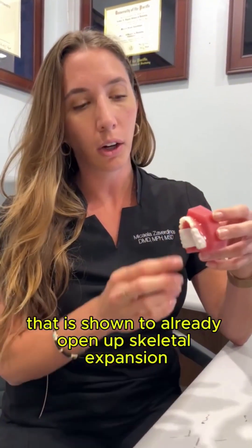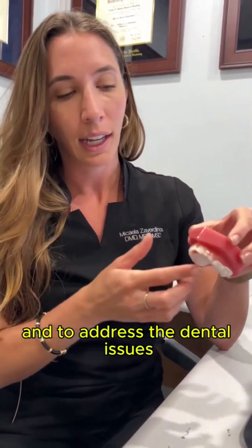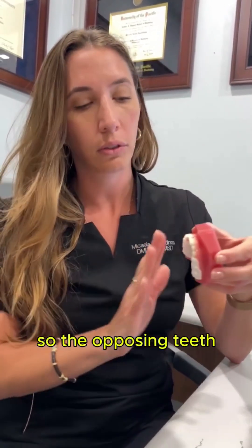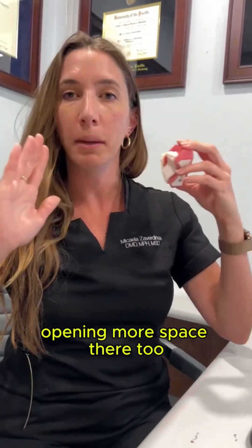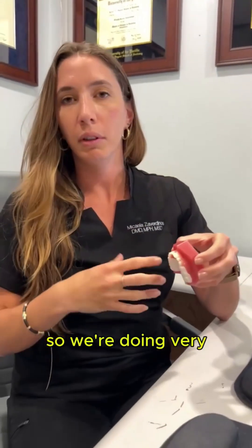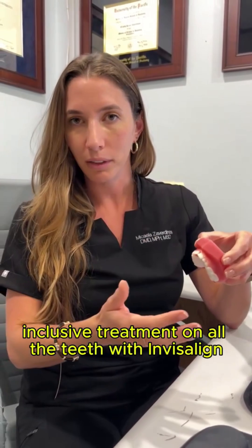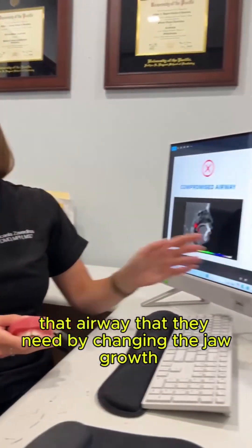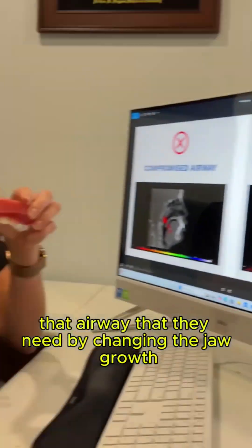It is shown to already open up skeletal expansion and to address the dental issues. While we can comprehensively treat the lower arch — the opposing teeth — opening more space there too. So we're doing very all-around inclusive treatment on all the teeth with Invisalign phase one, and we're going to give them that better result — that airway that they need — by changing the jaw growth.